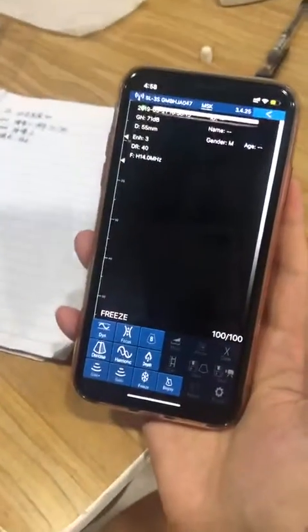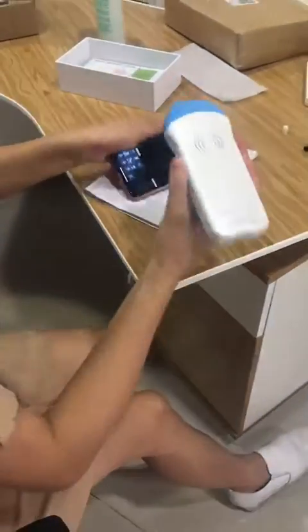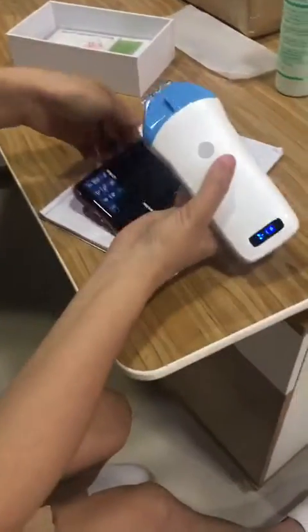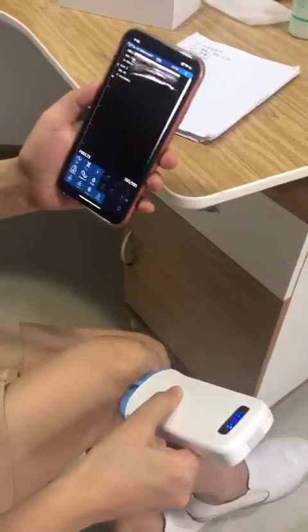Okay, now the DR — you know — so let's begin the skin. Firstly, we put some gel. How does the gel look? Okay, after I put the gel you become bright. Okay, we'll see yeah.